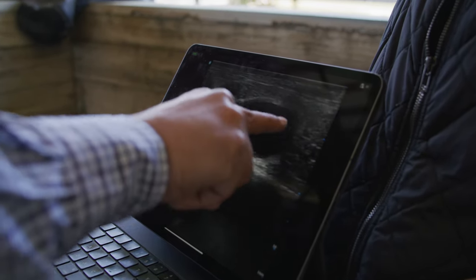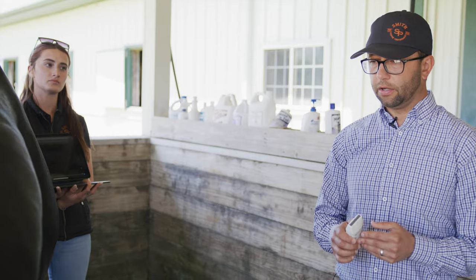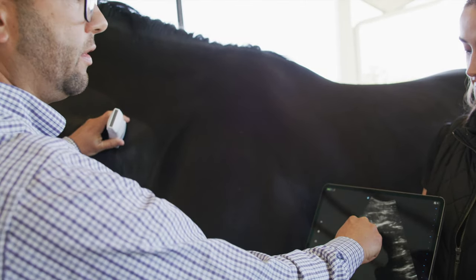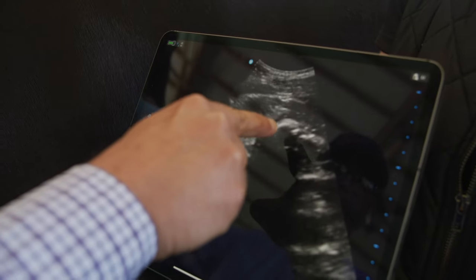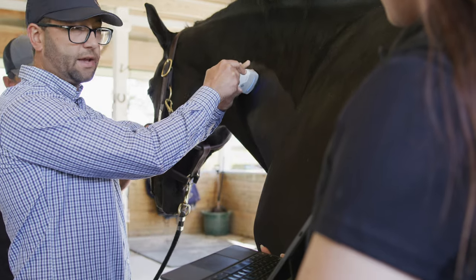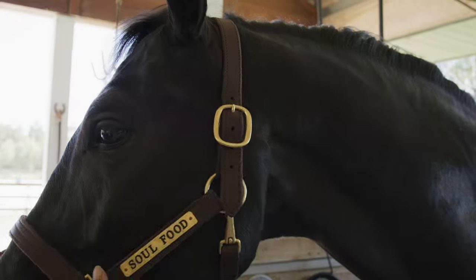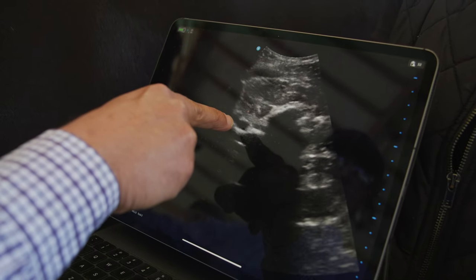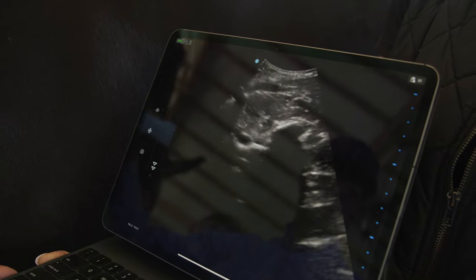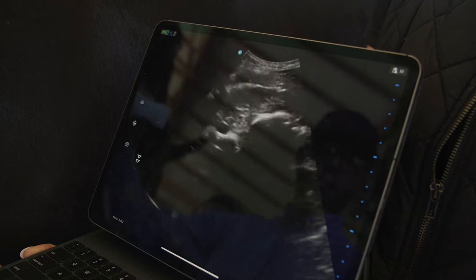What I've started using this primarily for is ultrasound-guided injections. When we're injecting the facet joint — this is the facet joint in the neck right here — if we're injecting the neck, it's the lower neck facet: four, five, six, seven. The reason I use ultrasound is that right there is a really big blood vessel, and if you're off and you hit it, this horse is going to get about a basketball-sized swelling on the side of his neck.